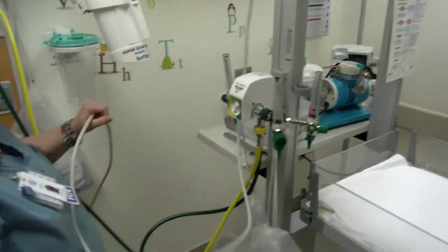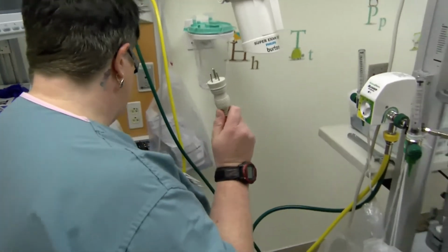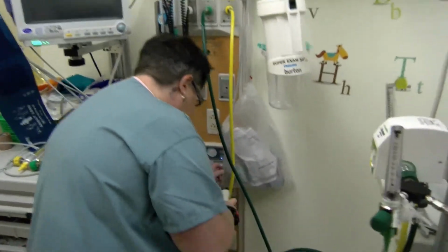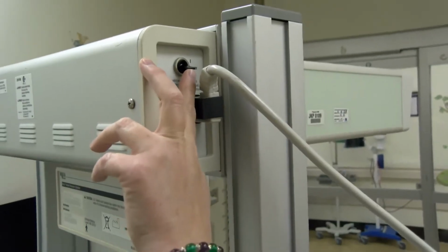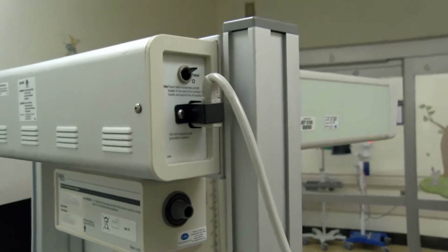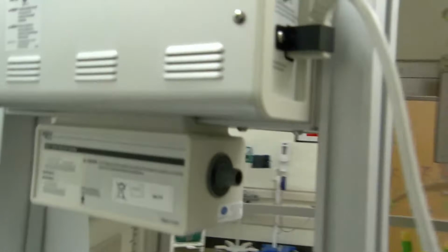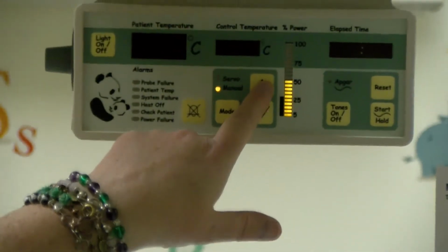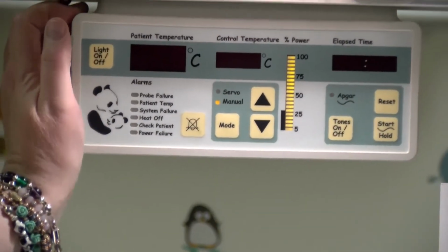The final thing is the Panda Warmer does not have a battery. So you will have to plug this in to a red outlet in case of power failure. Toggle switch on top, you're going to turn that on. The front of the machine will start lighting up. It will go into the manual mode of preheat. For manual mode, it comes on at 50%. If you're expecting an immediate delivery, go ahead and put that up to 100% to rapidly heat the warmer and turn on the light so you can see what you're doing.